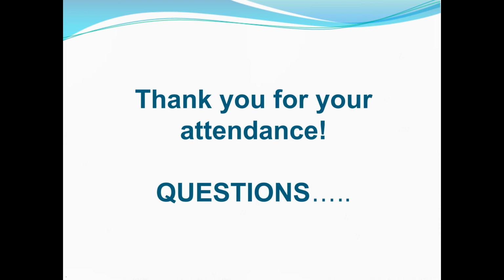Perfect, thank you. Next question, which gram-positive bacteria is having trouble with good identification? Sometimes our Staph aureus, sometimes coag-negative staph. It's really just those two tend to give us that issue. So like I said, with the formic acid, that does help, but sometimes it doesn't help enough that we have to do the extraction on the staphs.